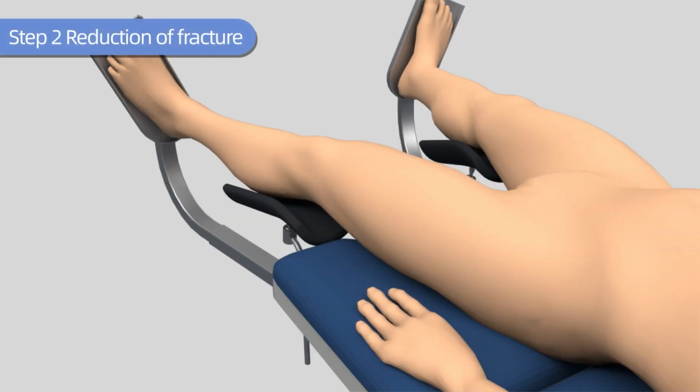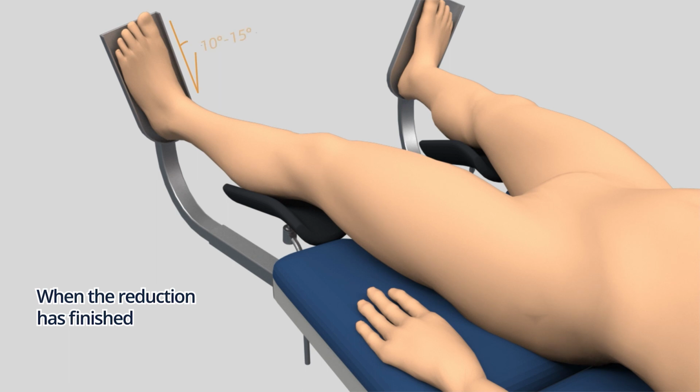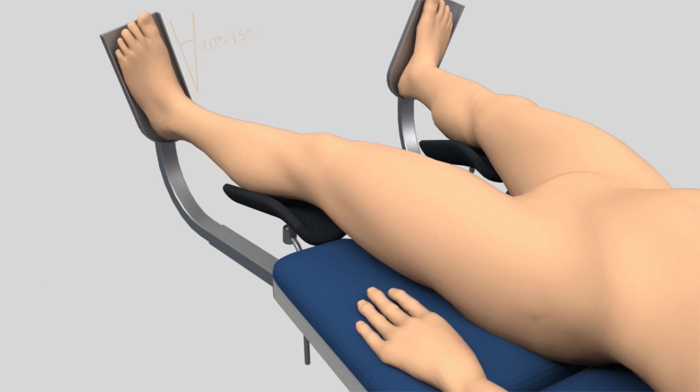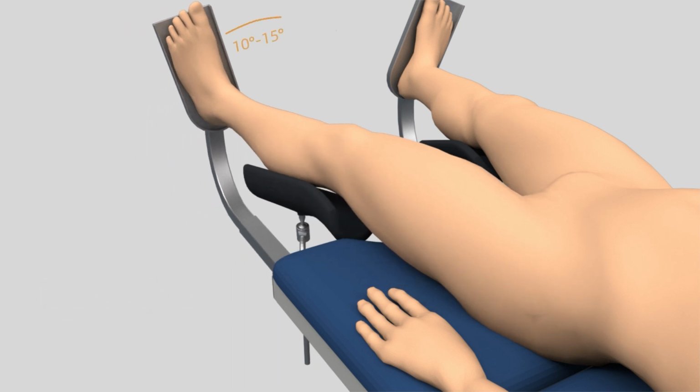Step 2. Reduction of fracture. Conduct reduction on fractured bone. When the reduction has finished, internally rotate the affected limb by 10 to 15 degrees, or more. Adduct the affected limb by 10 to 15 degrees. Fix on the traction bed.